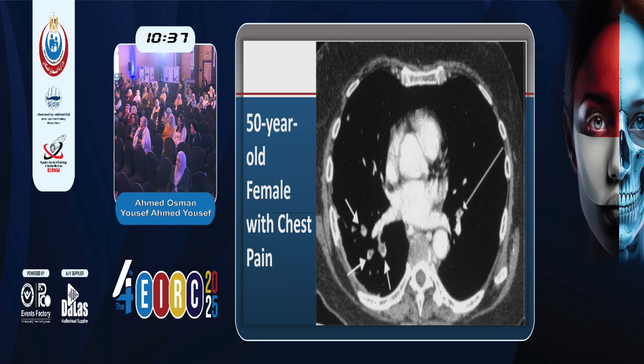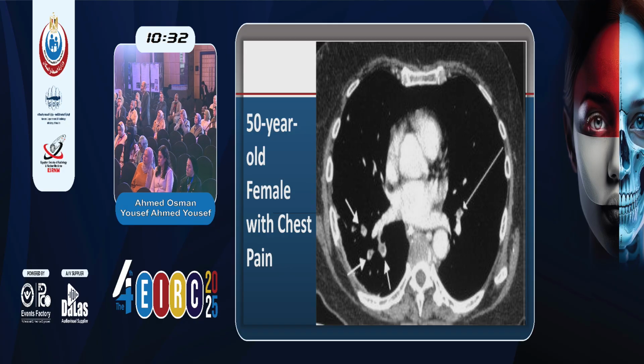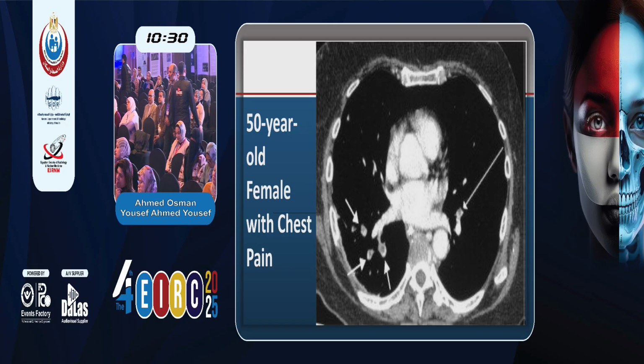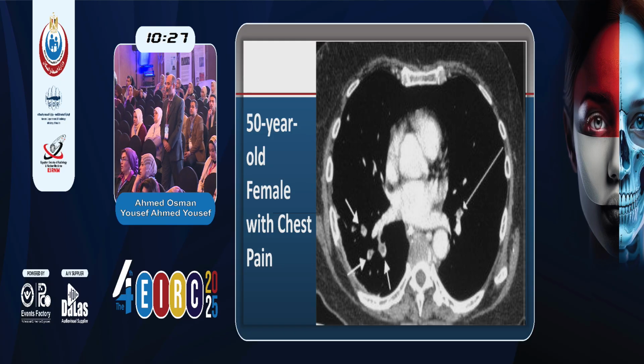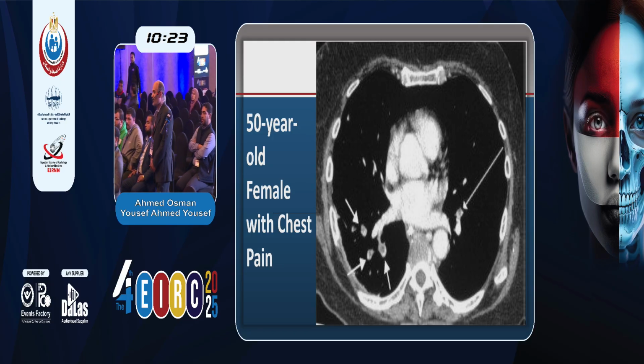A 50-year-old female patient with chest pain. Pulmonary vein thrombosis.